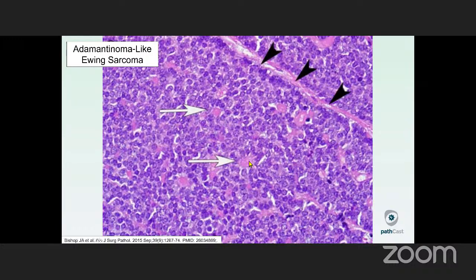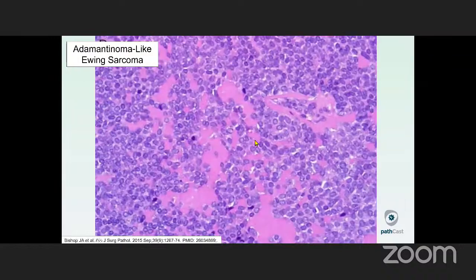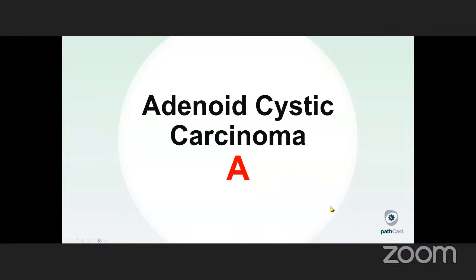sometimes these little hyaline-filled rosette-like structures in there, sometimes a little bit of hyaline stromal material in there. And again, the nuclei are all about the same size with relatively open chromatin. So some clues. Ewing sarcoma is one of those where you don't want to miss it. If you don't think of it and don't include it in your differential, don't stain for it, you're going to miss the rare cases when it pops up on your microscope and in your queue.